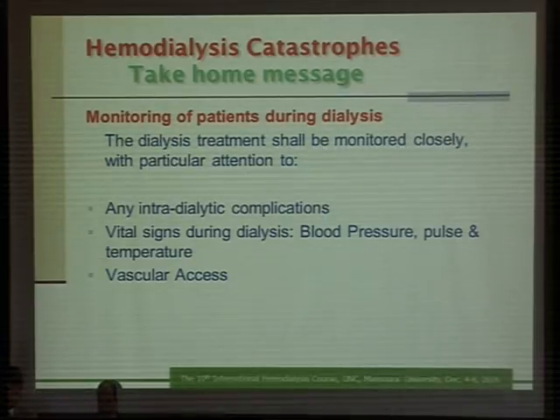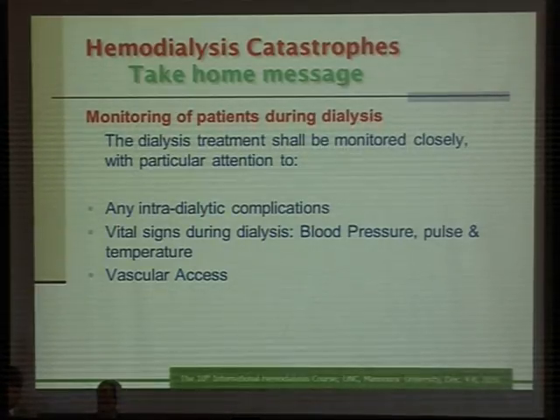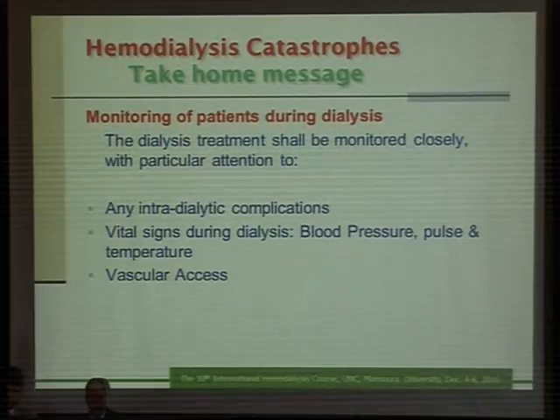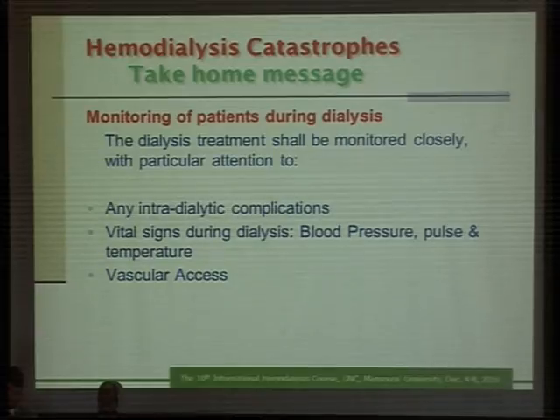Monitoring the patient during dialysis is very important, especially the vascular access and the occurrence of any intradialytic complications and, of course, the vital signs.